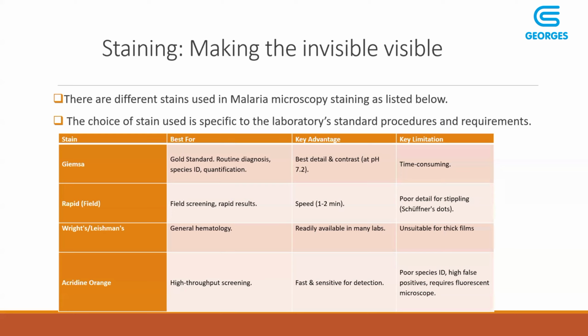It takes 1 to 2 minutes to stain, but it has a key limitation because it does not give good detail of stippling. For example, the Schüffner's dots cannot be well seen when you are doing your malaria staining using the Field stain.